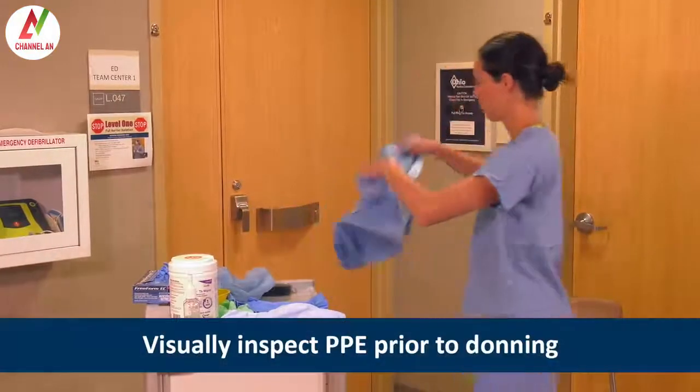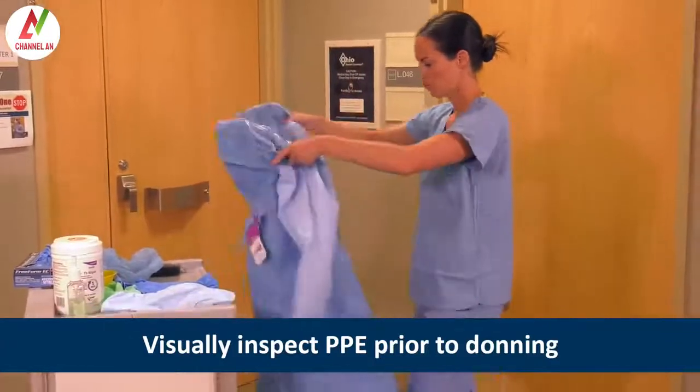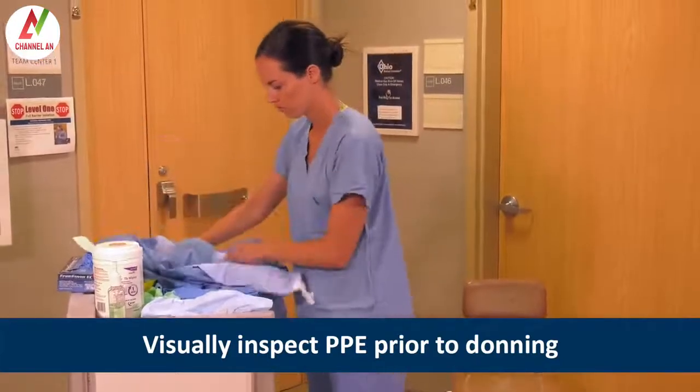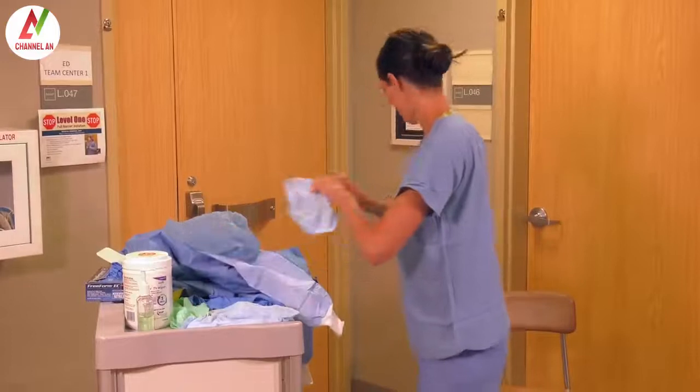Heather visually inspects all PPE prior to donning to assure that it is not torn or ripped. This demonstration uses a gown ensemble. She selects the correct size PPE, ensuring that the gloves fit properly and her gown falls to mid-calf.